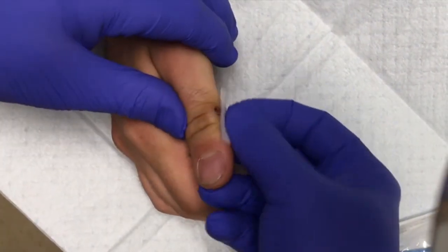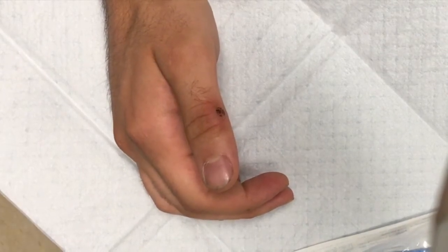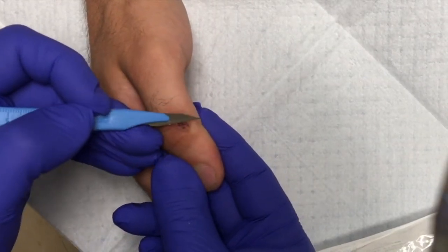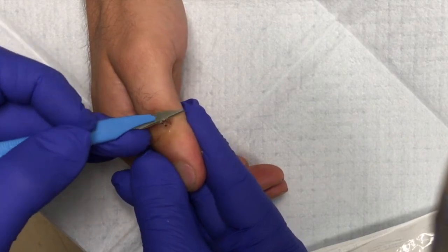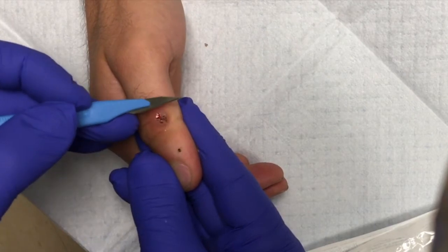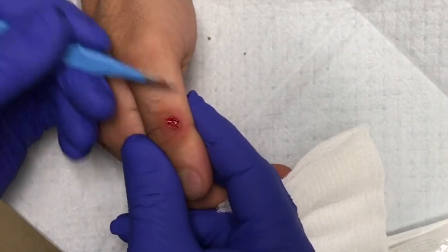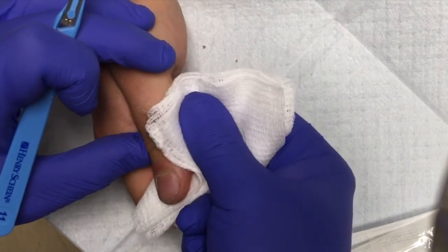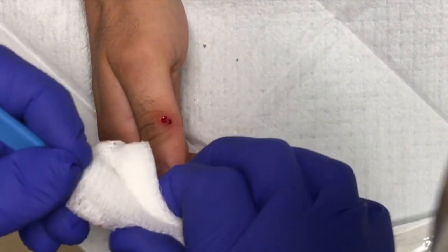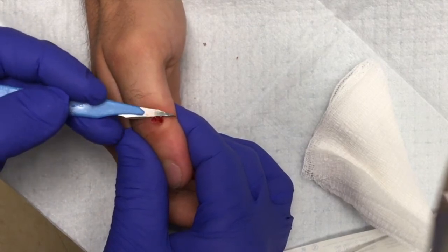Nothing we do is really going to get rid of it directly, so we want to get as deep as possible and injure the area without hurting you too much. Any pain? You can see these little dots here — that's where the capillary blood was, and that's what we're trying to get to. It's bleeding a little bit already. We're just going to keep shaving lightly. You can see a little capillary blood flow right there. When we see those little dots, that usually means we're deep enough.